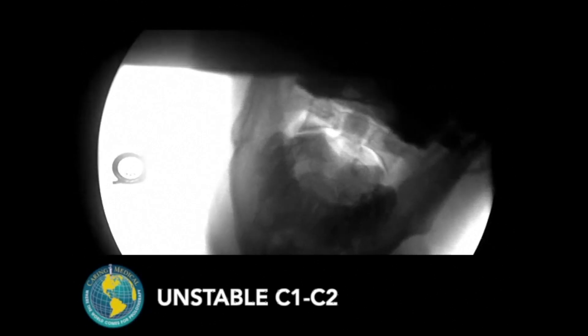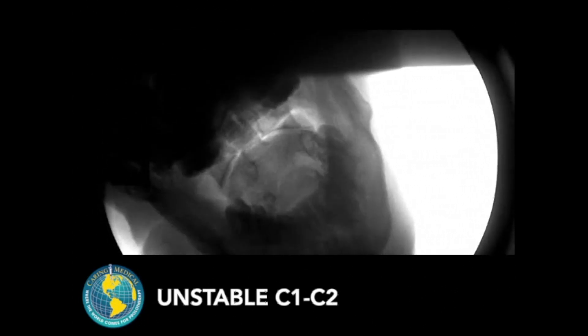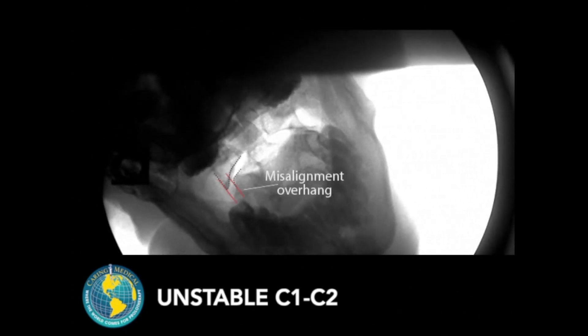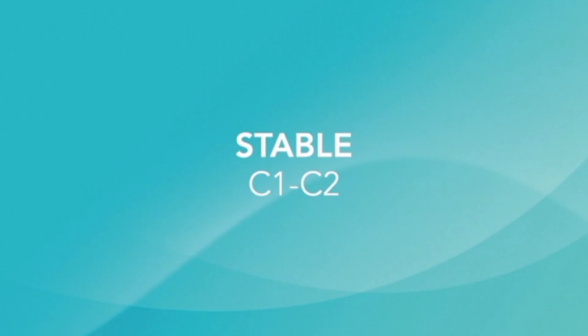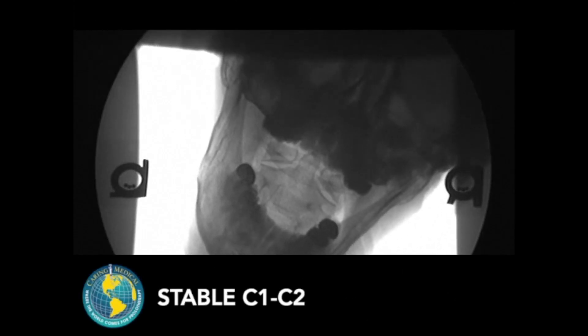Digital motion x-ray is a great tool to show instability at the C1-C2 facet joint. The amount of misalignment or overhang basically tells the degree of instability. This particular patient had severe instability. Fortunately, this can be treated successfully with prolotherapy to the injured, torn, stretched-out posterior ligaments that are causing the instability.